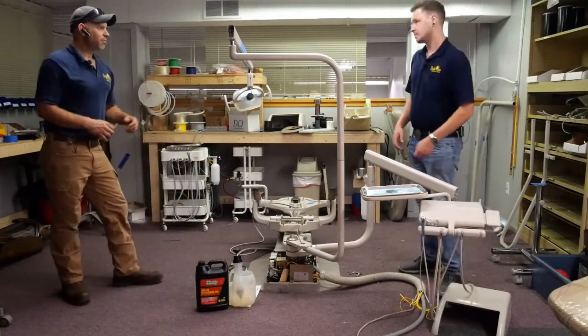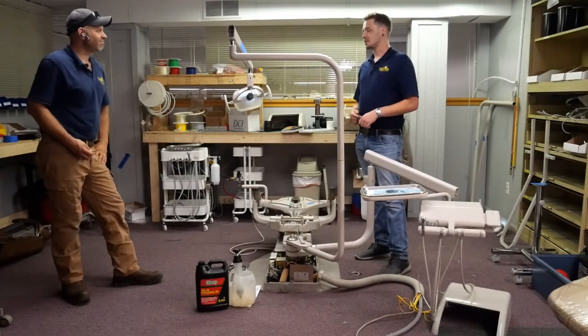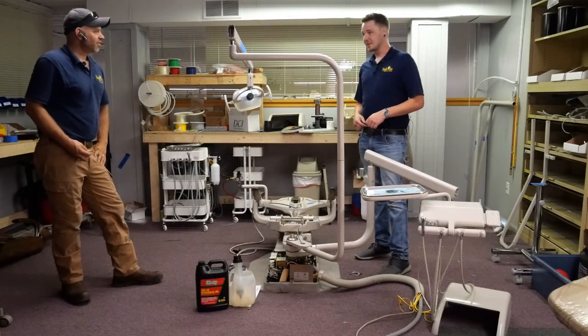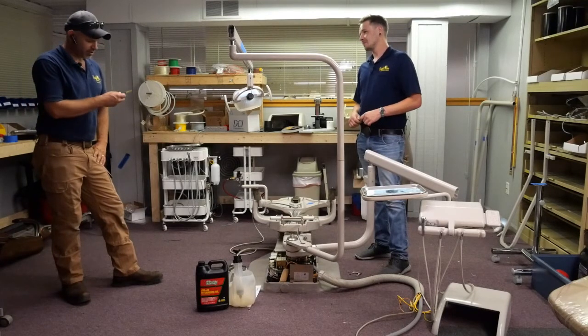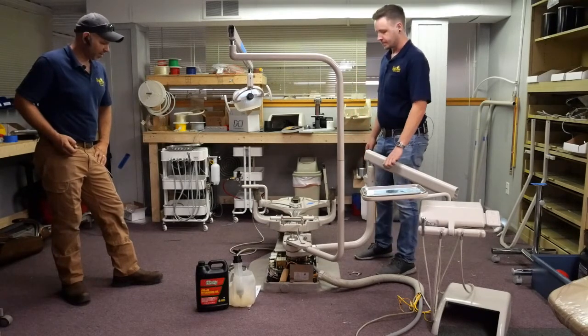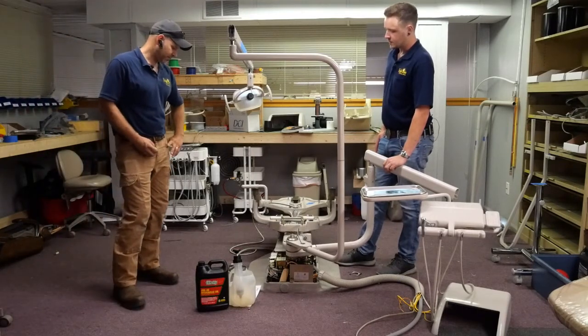Now, Calvin, what do you think about that? I think it was great. Is there anything you would add to that information? Lots of useful information. Just got to be careful. Don't electrocute yourself. What's your favorite tip regarding this system? Is there anything that you've learned with regard to the oil? I think just the speed.